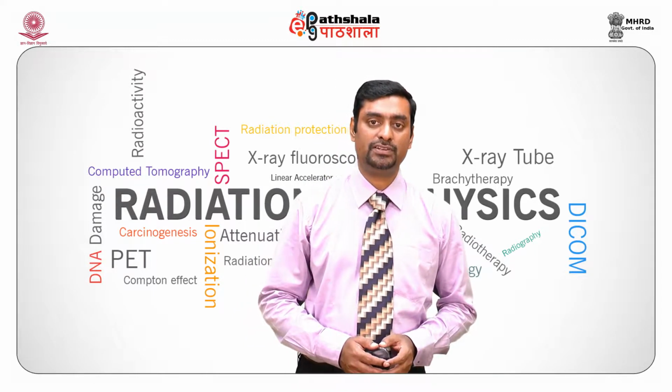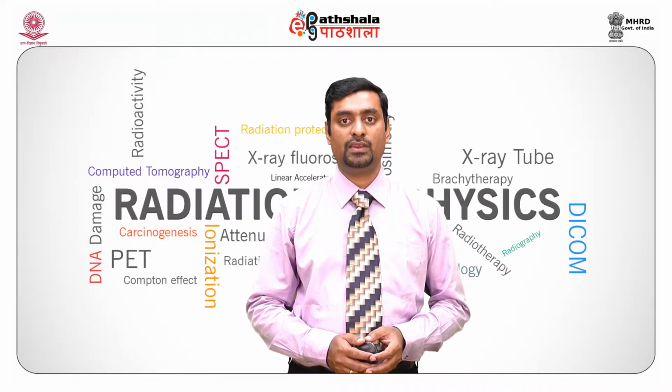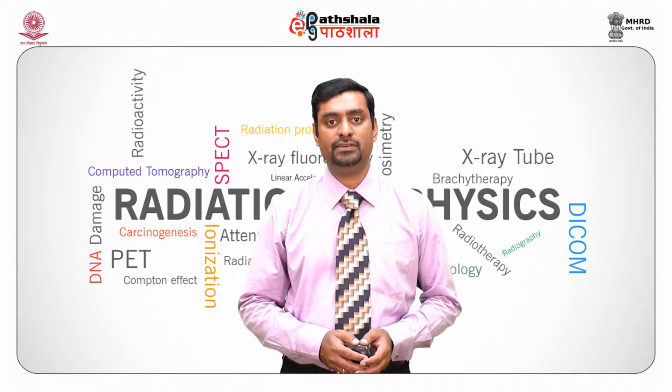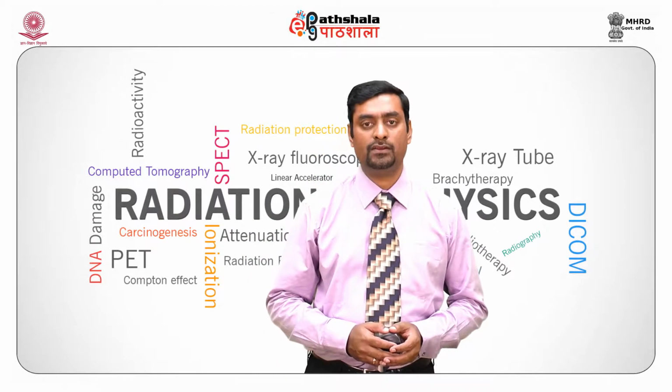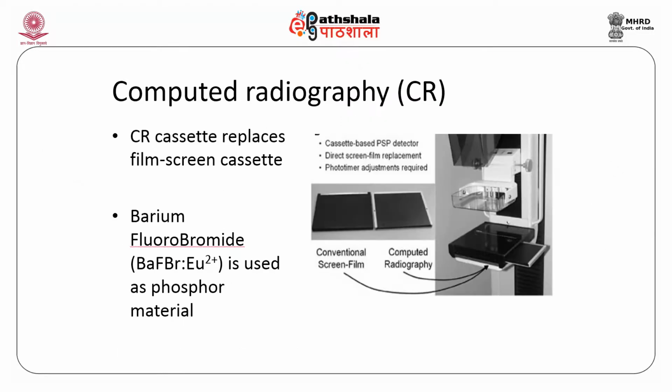Increased efficiency and patient flow is possible with digital mammography detectors. It also enhances image quality, and there are a lot of options available in digital mammography which are not available in a film screen combination. In this image, we see the response curve of a film and a digital detector. We see the film's characteristic curve as well as the wider latitude in a digital radiography system. The exposure and optical density are independent in a digital detector. Let's look into a computed radiography system.